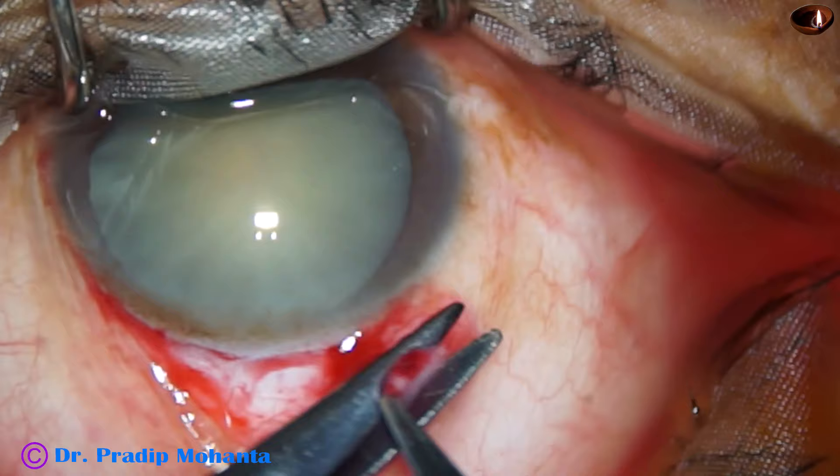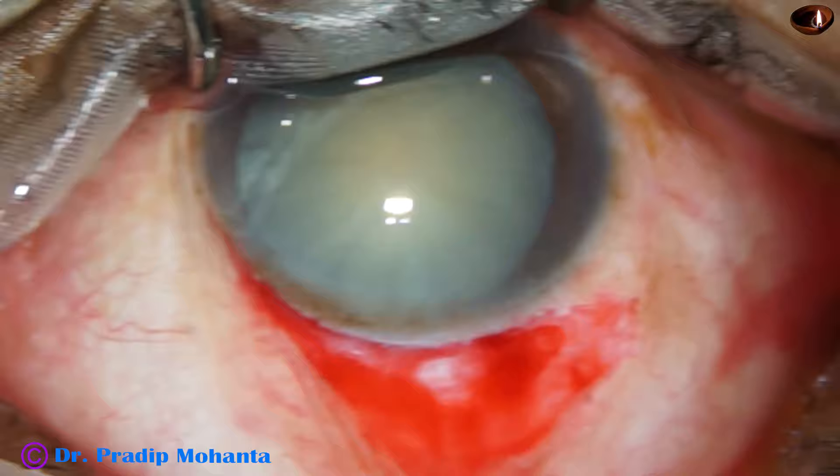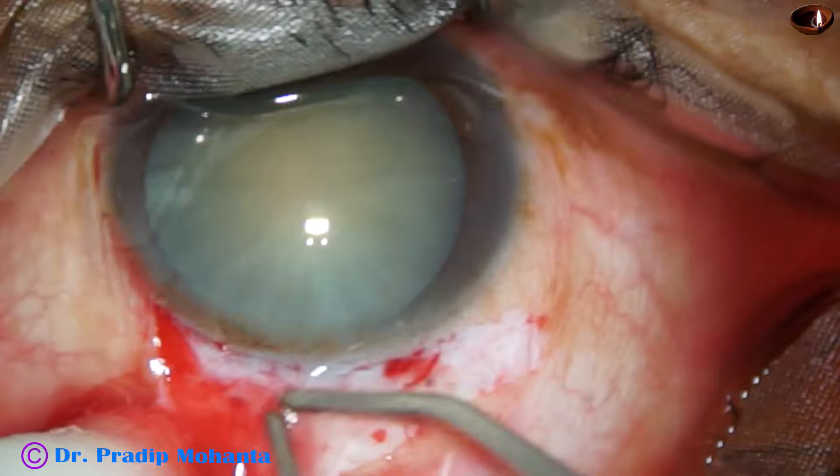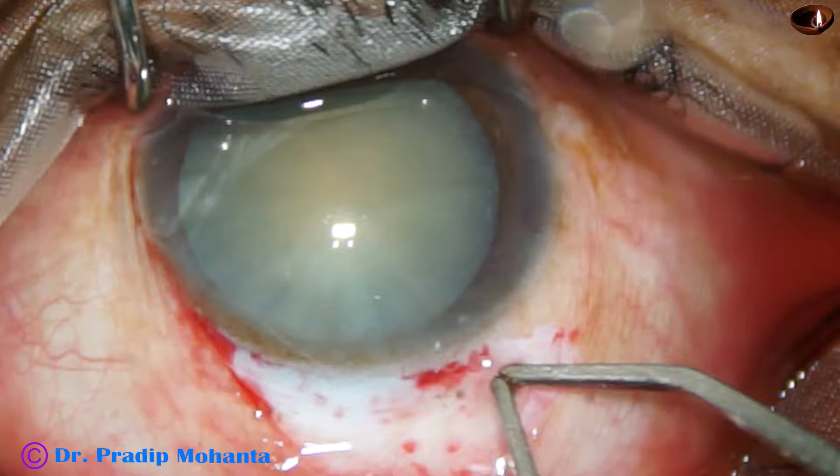The conjunctival peritomy has been done. The Tenon's has been trimmed a bit, because if the Tenon's is exposed it can cause granuloma postoperatively. Now, wet field cautery is done — very mild cautery, just touching over the blood vessels.